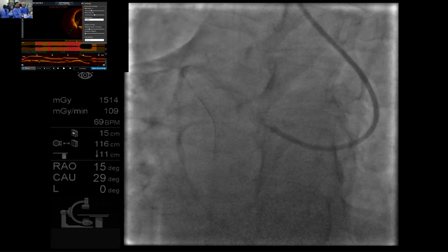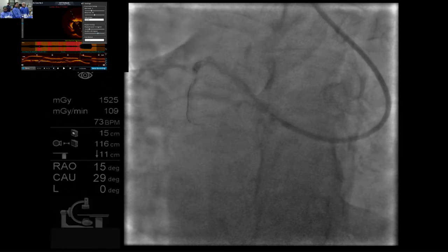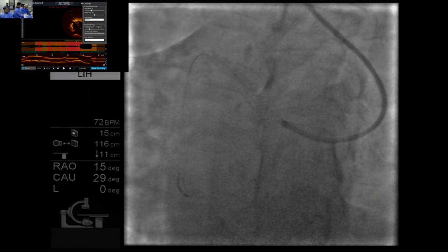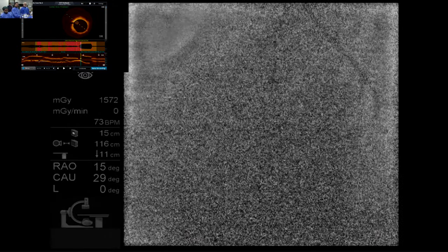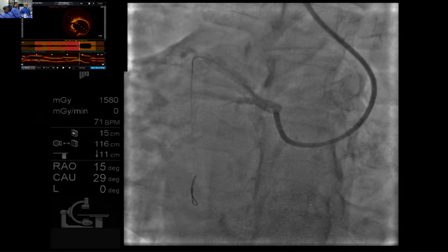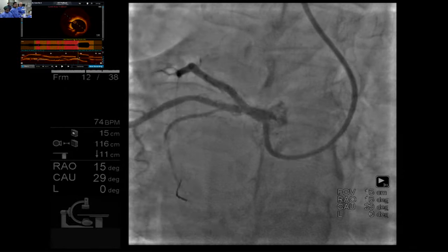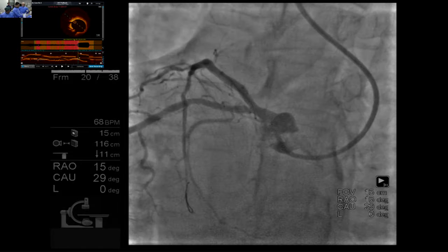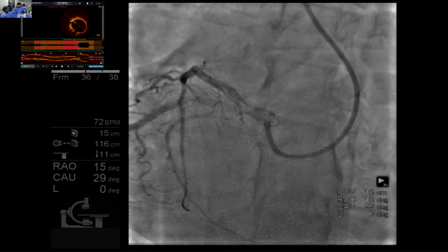Just check it out. Is it the early septal wire? Early septal. No diagonal. This looks better. Yes, perfect, okay, fine. Perfect. Check it out. Let me just engage it properly. Just check it now. Yes, we are in. Super. Some pinching. Some pinching, but that is not pinching, Sanjay. That is the stent strut protrusion inside. Let us check it. And if need be here, we can take one more run for the ostial circ. Let us see.